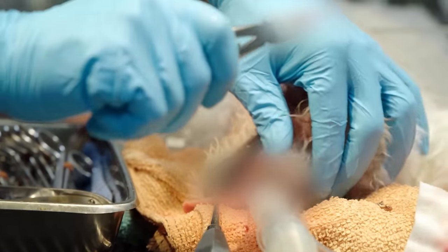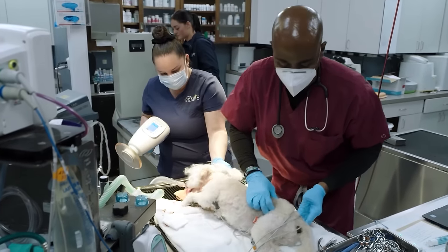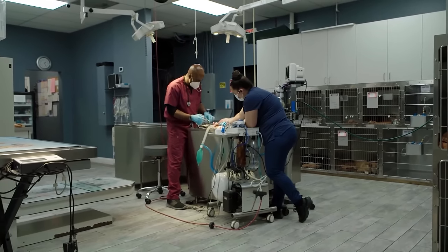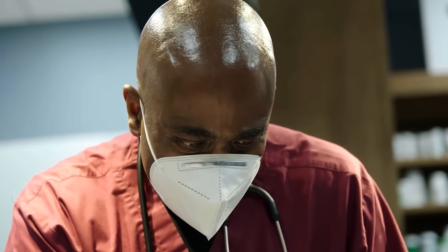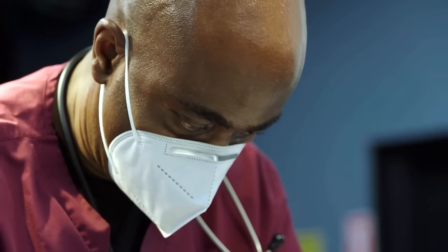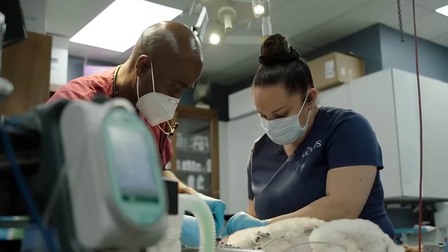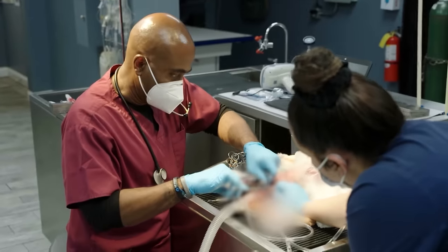So we're still finishing up one side. We still have a whole other side to do. Chances are he's gonna have an oral nasal fistula on the other side that I'm gonna have to create a flap for and close as well. You see that gaping hole? The same serious defect on the other side of his mouth. Got to drill some of the bone back here. Means even more risky time under anesthesia for an elderly dog with a perilous heart condition. This is probably one of the worst fistulas that I've seen.